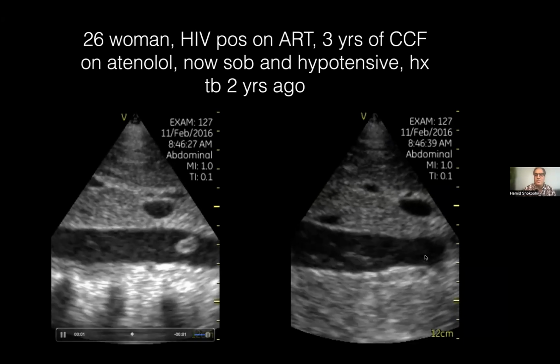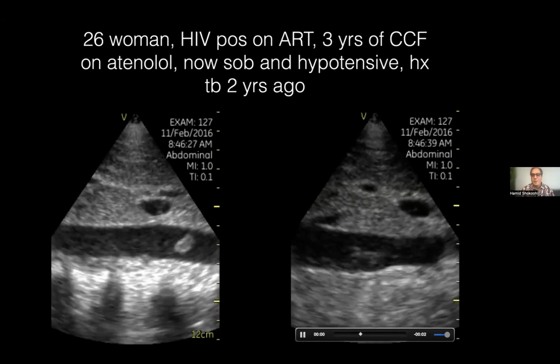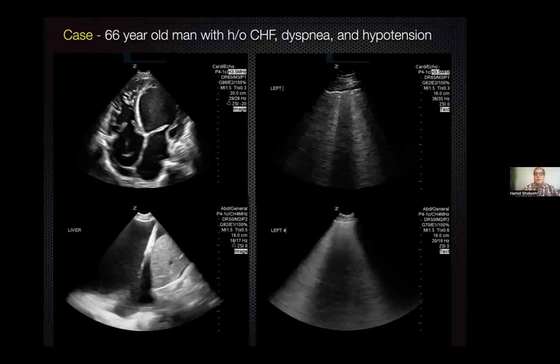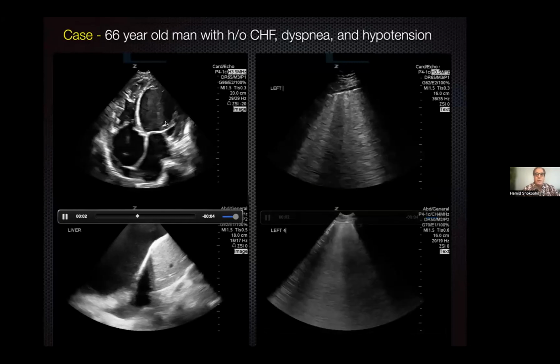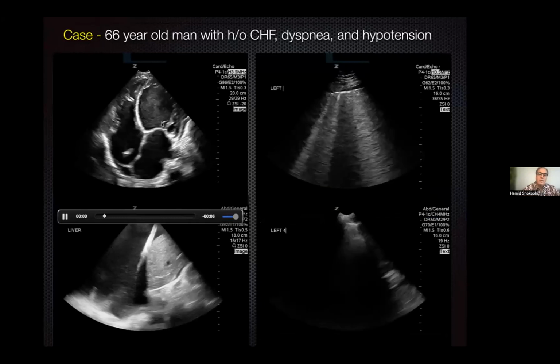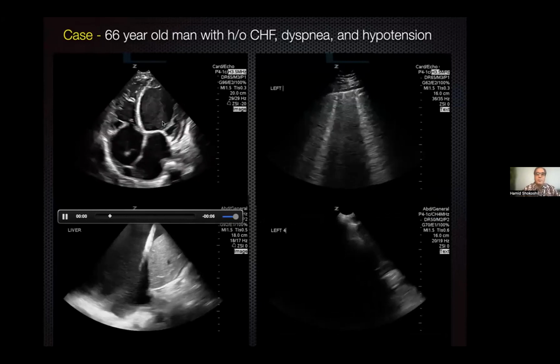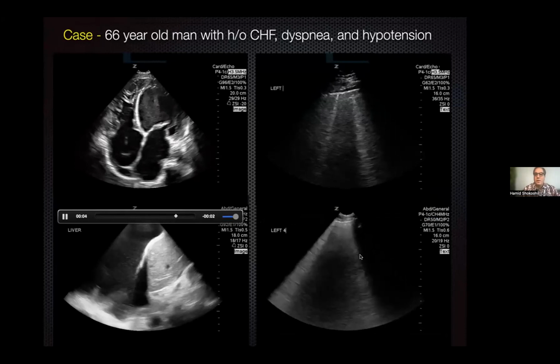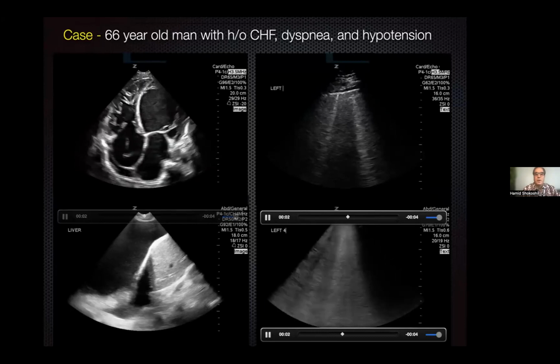This patient was treated for worsening CHF. Now you're dealing with this as a result of the PE. With CHF, as you can see here, the LV is absolutely not moving. When you have auto-contrast in the LV, the ejection fraction is less than 20% for sure, because the fluid is moving around itself. And you see this along with multiple B lines, so it's typical of cardiogenic shock.